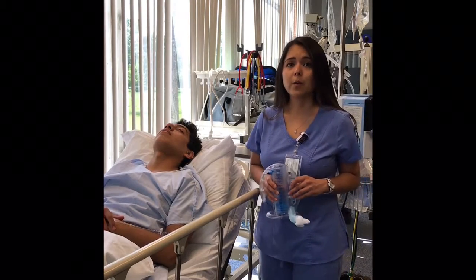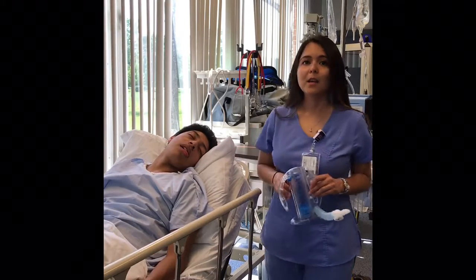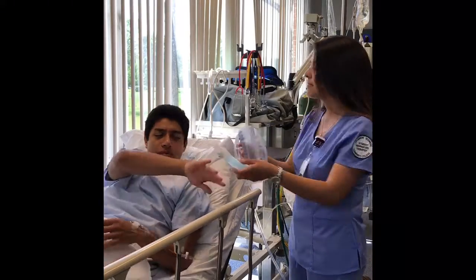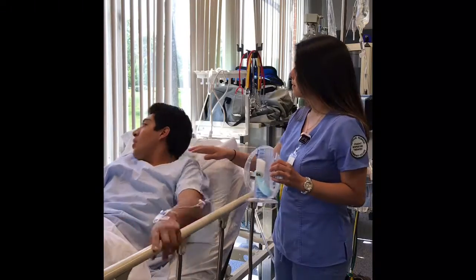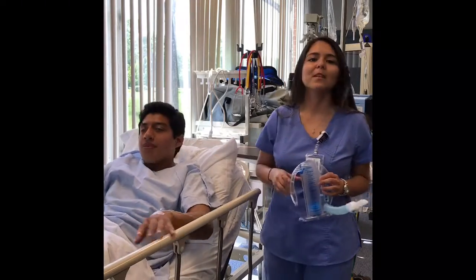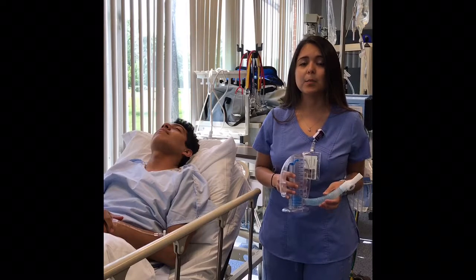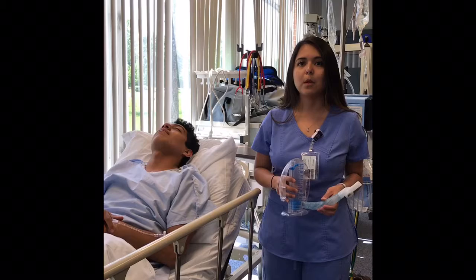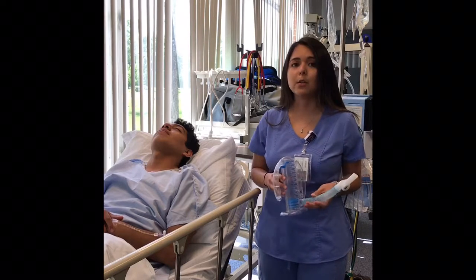Contraindications to this form of therapy include a patient who is unconscious, a patient who is uncooperative, a patient who is confused, a patient who has a vital capacity of less than 10 cc's per kilogram or less than 1/3 of their inspiratory capacity predicted. In other words, they are unable to generate a deep breath.